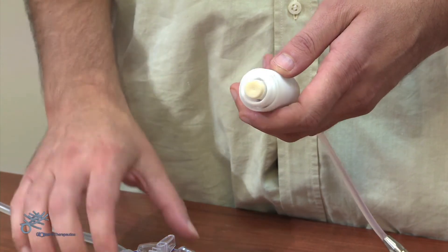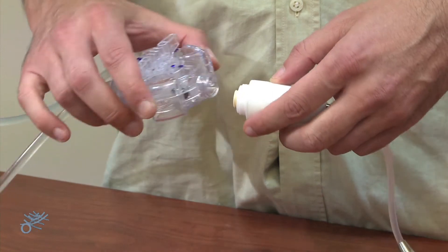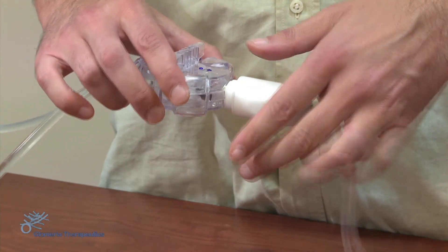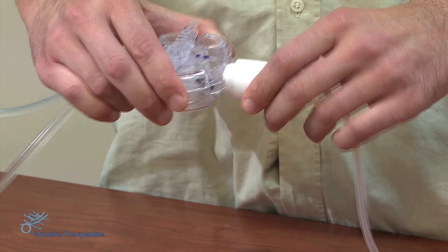We screw the newly freed extremity of the Desmo connector to the extremity of the Desmo patient set until we hear the confirmation click of the anti-unscrewing wings.